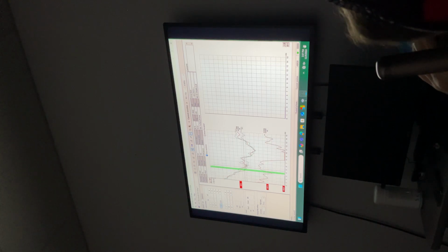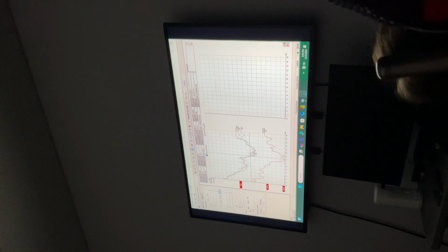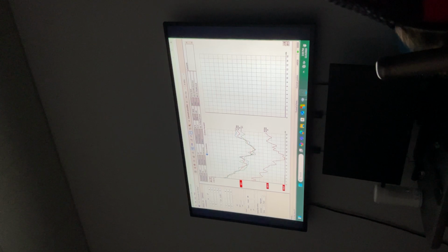Something is wrong here. Yeah, the latency normative. Again, marking here or here, both of them are correct. Again, it's already a really big signal to noise ratio. It's about 3. Okay.